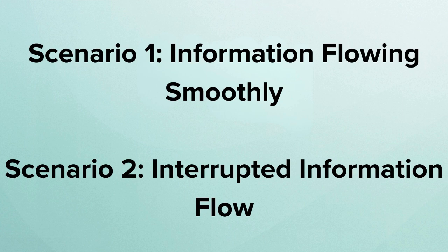We're going to be looking at two different scenarios today. First one is kind of the happy path where all systems are in place and information is flowing seamlessly and interoperability exists. And then we'll actually show the unhappy path where we have a break in that PCIM interoperability, and as a result, information is not flowing ideally for the patient.